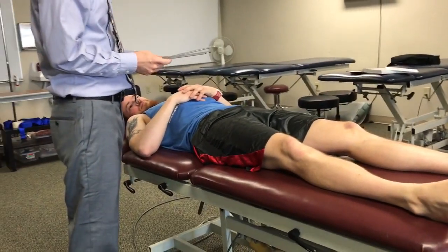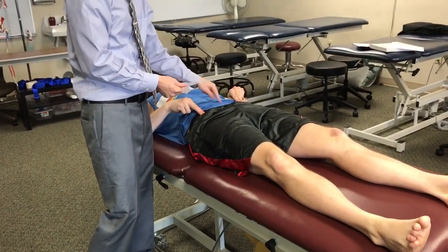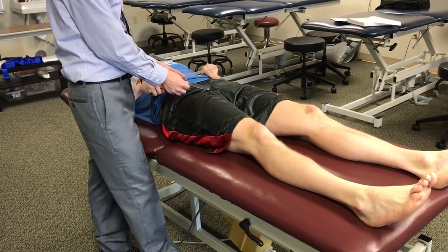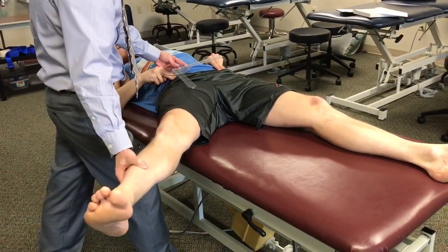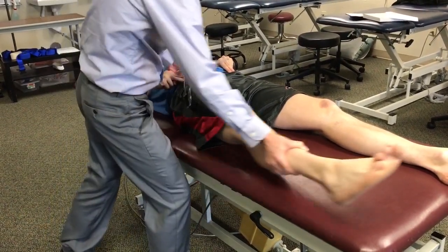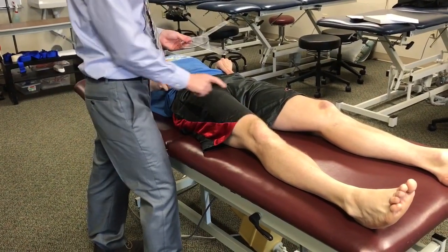Then we can do hip abduction and hip adduction. For abduction I'm going to ask the patient to palpate his ASISs. We're going to use an imaginary line between these two landmarks as the stationary arm's landmark, then use the midline of the patella to guide our movable arm. This can be done passively or active assistively. I take him out to end range — once I move past end range I start to see his pelvis drop or hike on respective sides, so that's when I take the measurement. The fulcrum is the ipsilateral ASIS, stationary arm along the imaginary line between the two ASISs, and movable arm along the midline of the patella.